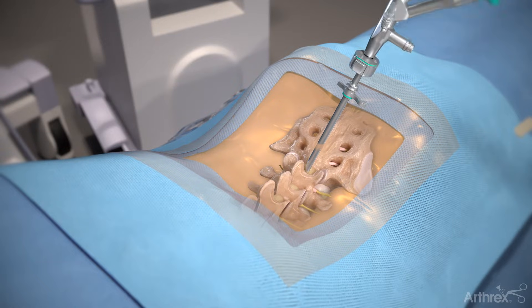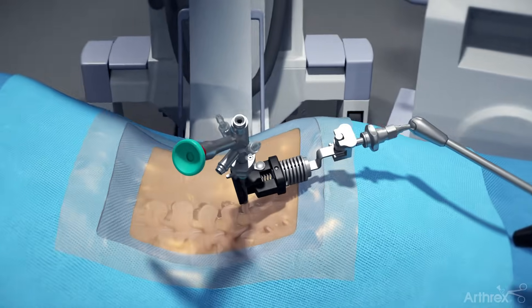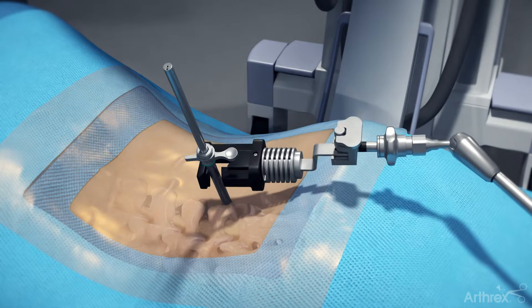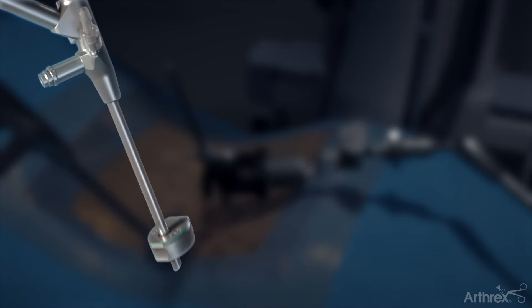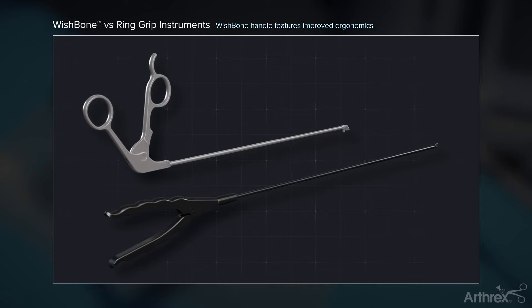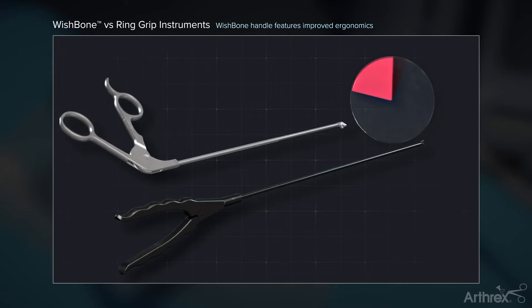Insert the endoscope into the cannula. The surgeon may choose to connect the cannula holder to aid in maintaining the trajectory. Connect the holder to the cannula prior to the switching stick being removed. A depth stop may be attached to the endoscope to maintain the depth within the cannula. Arthric offers a unique wishbone handle design that allows for improved ergonomics and mobility for the instrument by the surgeon.